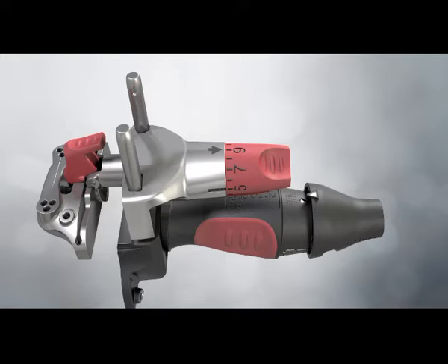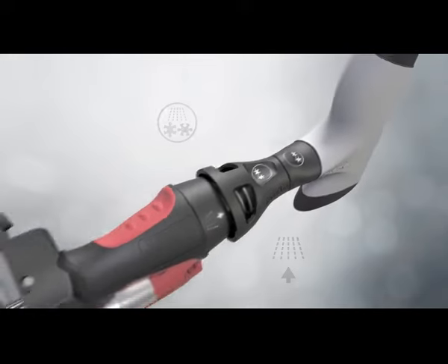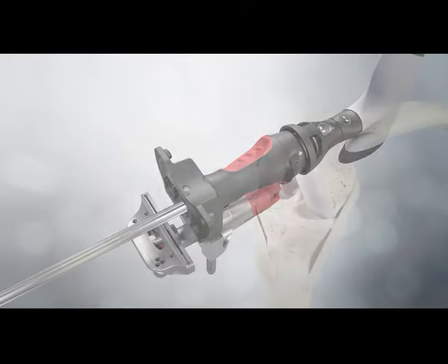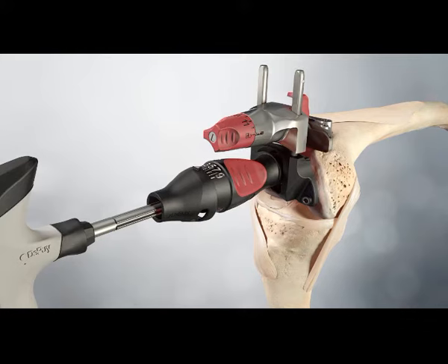The desired valgus angle is set on the distal femoral jig by pulling the dial back toward the knob. Note the assembly symbols which are used across the system. The IM rod is assembled into the jig and inserted into the femoral canal to the level of the isthmus. Slide the jig down the rod toward the femur until the distal plate contacts the distal femur.